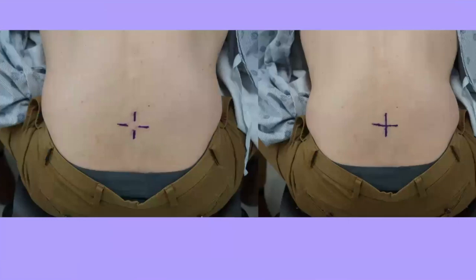So you've marked midline in your transverse and your longitudinal views. You have on the left what looks like almost a cross. All you do is connect the dots. And there you go.